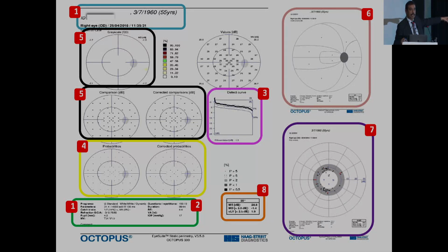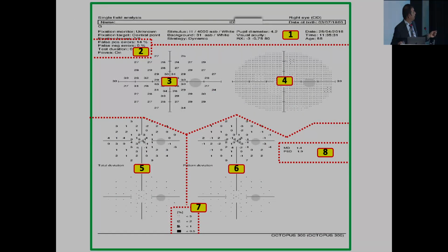This is the Octopus. If you really see that, that is called a catch trial. I thought you don't have a power. Your father has put in a good lens for you. Yes, sir. One out of 7, so that is coming as 14%. And 0 out of 8, so that is 0%. So that is called catch trials in the Octopus. It is not that difficult.